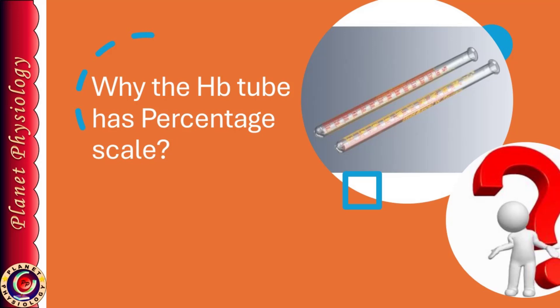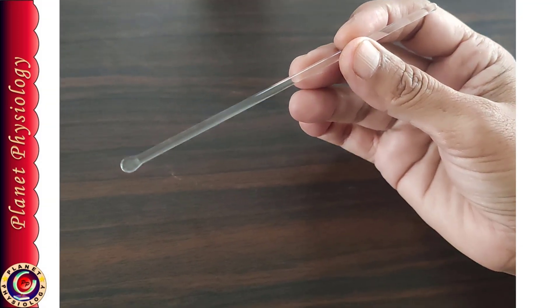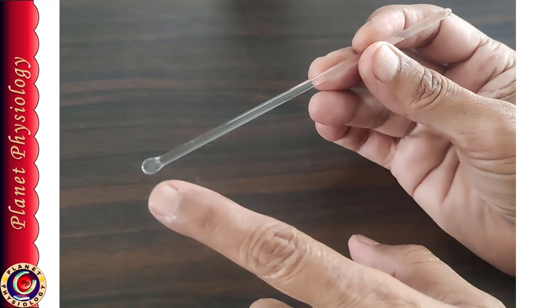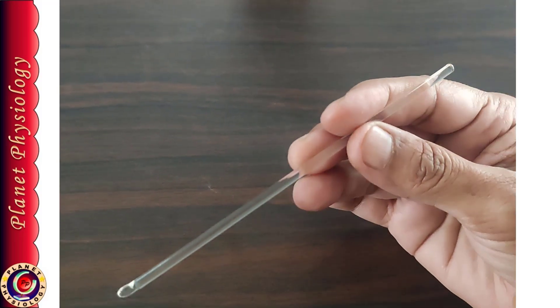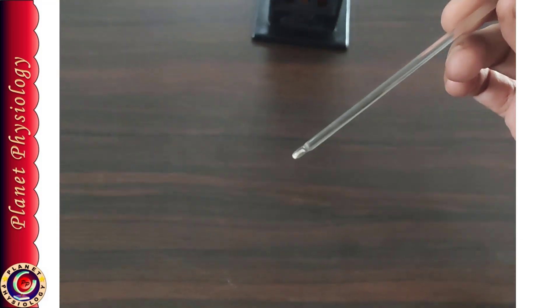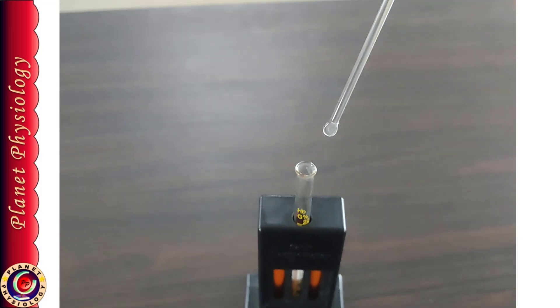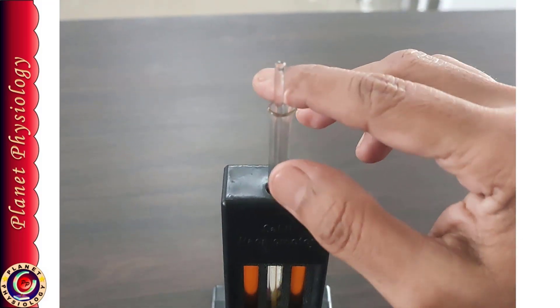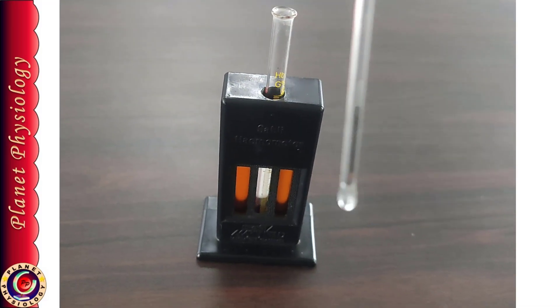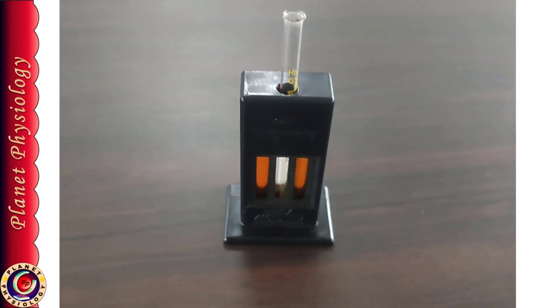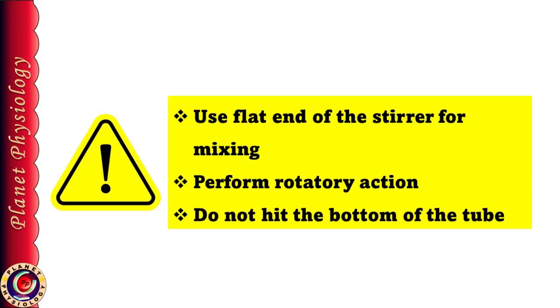The stirrer is a thin glass rod used to mix the contents of the hemoglobin tube. One end of the stirrer is flat and the other is round. The flat end is inserted into the hemoglobin tube and mixing is done by rotatory movement. Many students mistakenly use the round end and perform up-and-down movement — be aware that up-and-down movement can break the tube.